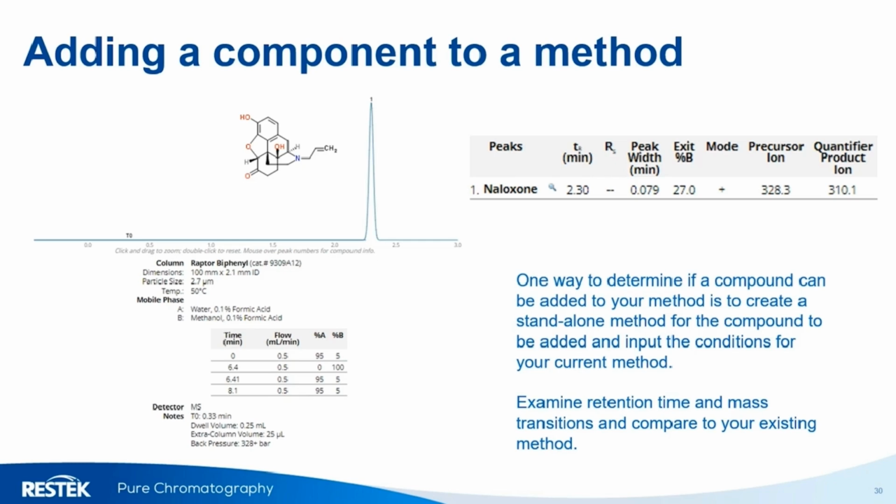But looking at this, I can see that the retention time comes out in a nice break between a couple of other compounds in the existing separation, and it is not an isobar with any of the other compounds in my separation.